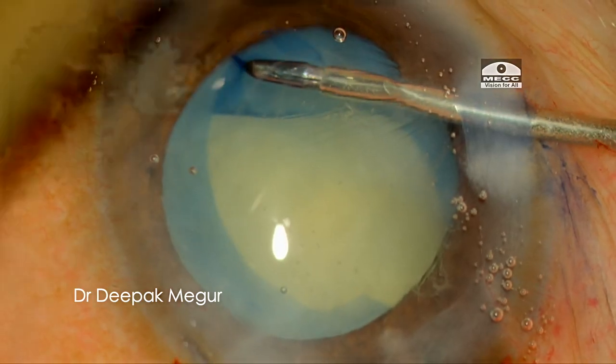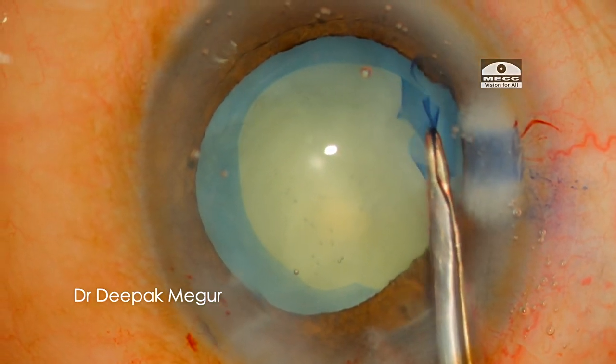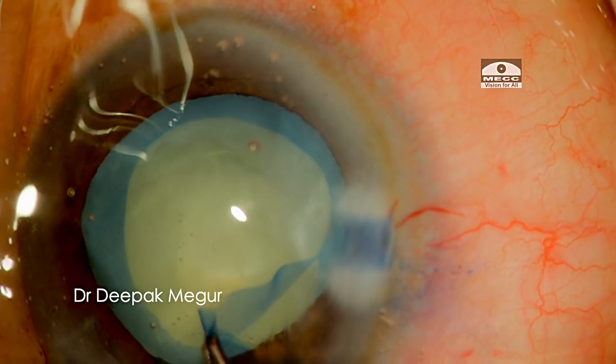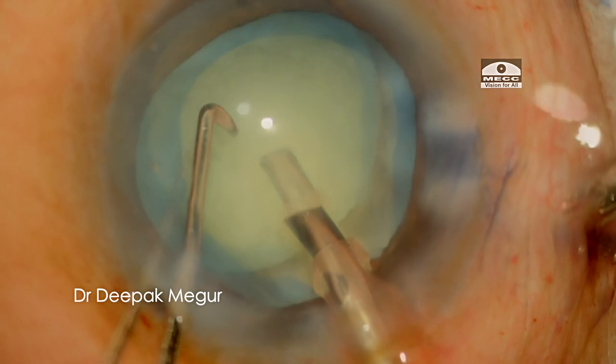At this point I made a conscious decision to continue with phacoemulsification and not convert to SICS, based on two criteria: first, the lens matter is quite soft so emulsification should not be an issue; and second, the pupil size looks adequate. So I proceed with phaco emulsification.